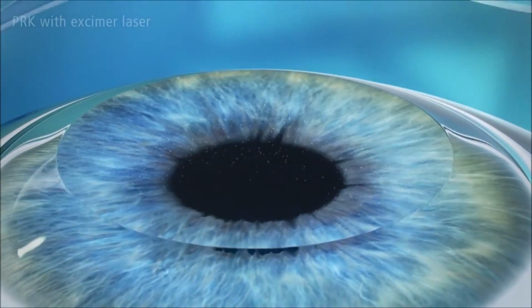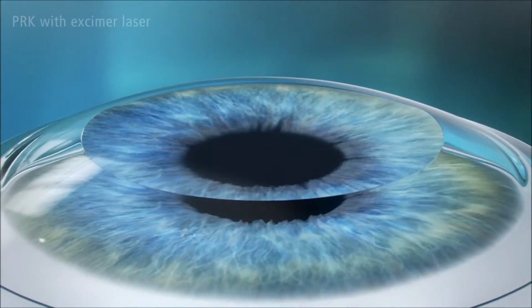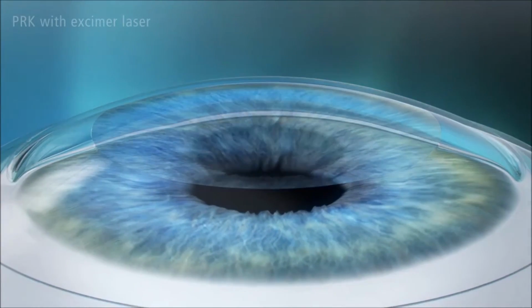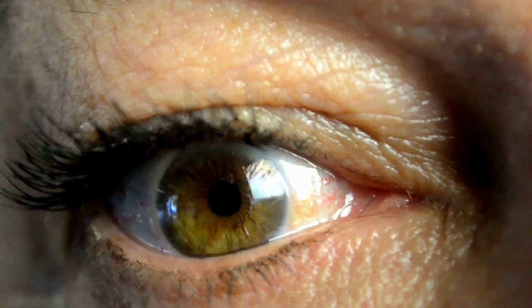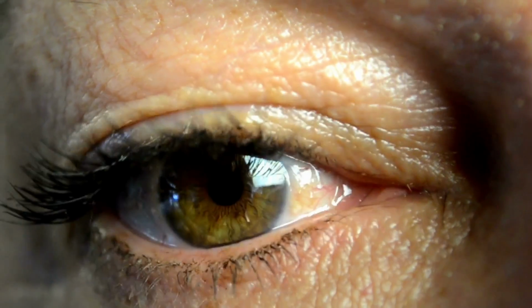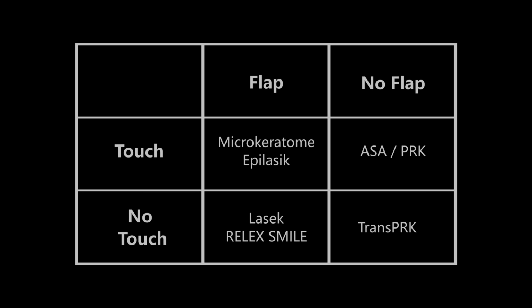Once done, a protective contact lens is placed over the eye in order to allow the epithelium to grow back, and after about 1 week the patient can go back to the doctor to have the bandage contact lens removed. The second method of no-flap surgery is the no-touch method. This method is called trans-PRK, and the surgery is done entirely by laser.